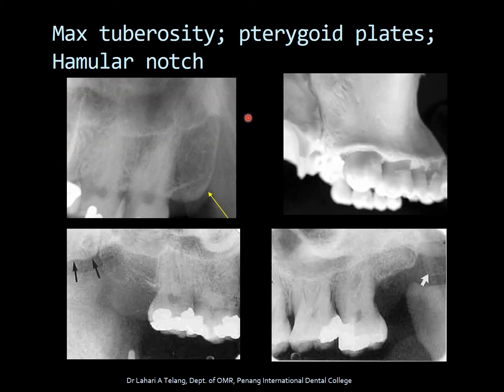The maxillary tuberosity is indicated by the yellow arrow mark — it is literally the end of the maxilla. The pterygoid plates are indicated by the black and white arrow marks, and the notch-like area is called the hamular notch.